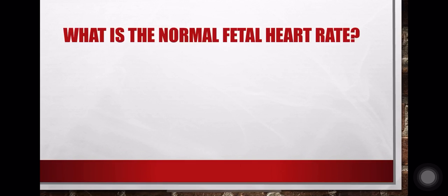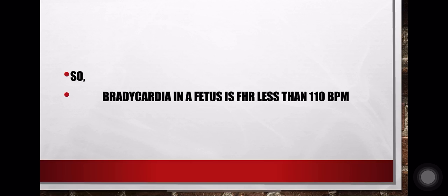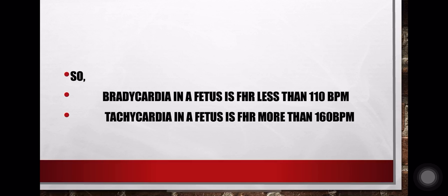What is the normal fetal heart rate? It is 110 to 160 beats per minute. So, bradycardia in a fetus is a fetal heart rate less than 110 beats per minute, and tachycardia in a fetus is a fetal heart rate more than 160 beats per minute.